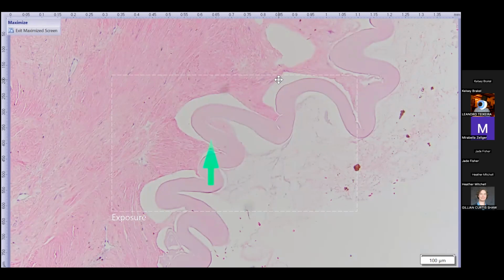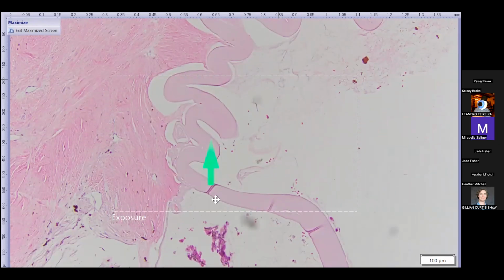And the lens fibers are completely resorbed, maybe expelled. Actually, this is one of the prettiest things. You can see this site of rupture in particular because we have that lovely, tight curl of that posterior lens capsule. Very pretty to see, which helps us, if we needed any additional evidence that this was truly an in vivo lens capsule rupture, there it is. So this is lens capsule rupture with hypermature cataract and resorption of most of the lens fibers, and it just stuck down onto the site of globe rupture in the back here.